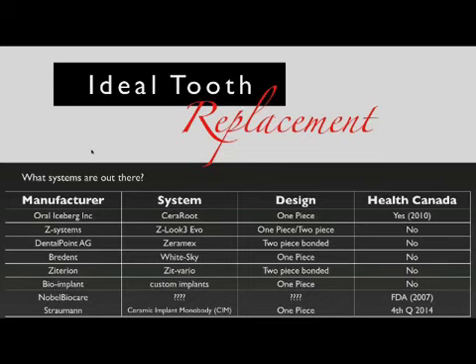With at this point a little bit of research behind it. I think Straumann has about 18 to 24 months of data on these implants. Oral Iceberg has had also over 10 years of data with the CeraRoot, and the same goes with Z system with the iteration of the new surfaces.